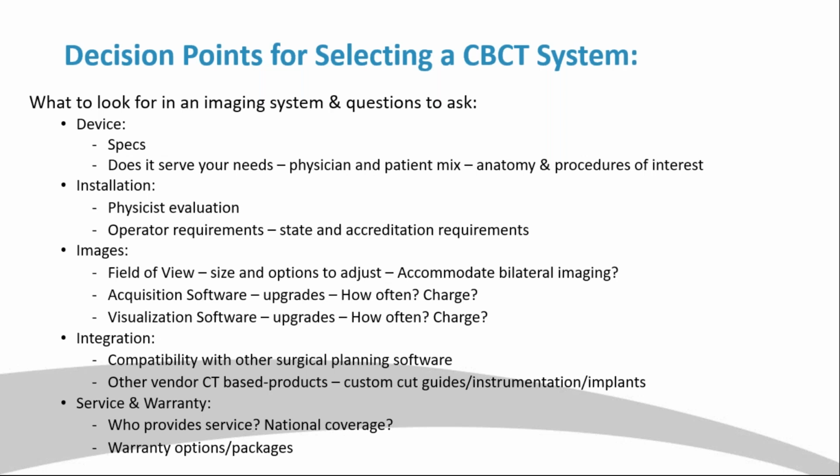Looking at installation and part of accreditation, you want to take into consideration that there is physicist evaluation. David spoke to this as well, and just working with whoever your manufacturer is to evaluate your space and make sure that you're meeting those requirements. And then also taking a look at operator requirements. So this is really important when you're considering it. There is that state variability, and there is variability between devices as well and different medical specialties. So you just want to make sure that you educate yourself on that as well.